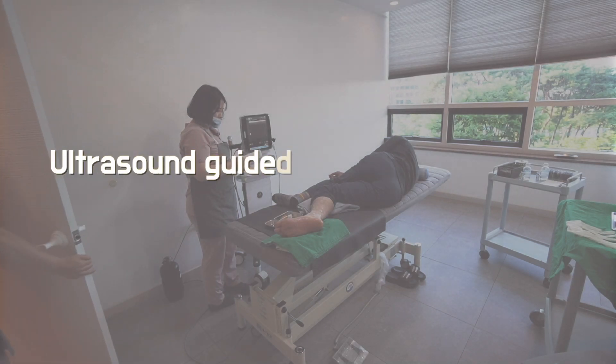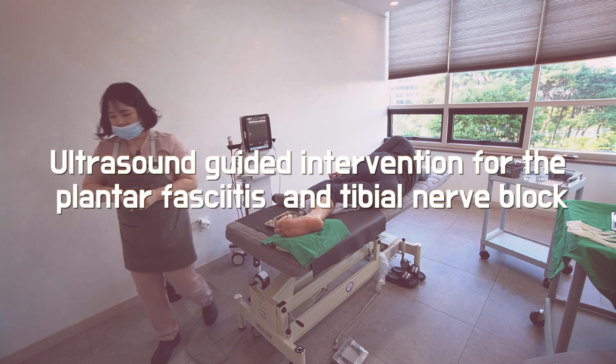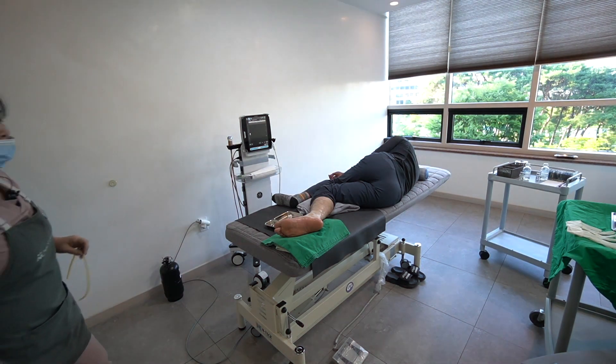Today I will share a practical ultrasound intervention for plantar fasciitis after blocking the tibial nerve at the medial ankle.